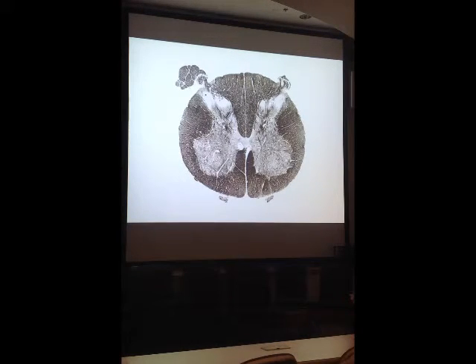Plate number 2. Again, the volume of gray matter is really, really big. So it has to be cervical enlargement or lumbosacral enlargement. But because the thickness of the white matter is so small, you should be able to tell that this was lumbar cord. And I've told you a couple times at least, maybe several times, that one question would likely be, name the part of the cord that's best represented by this section. And what part of the cord is represented here? Lumbar cord.